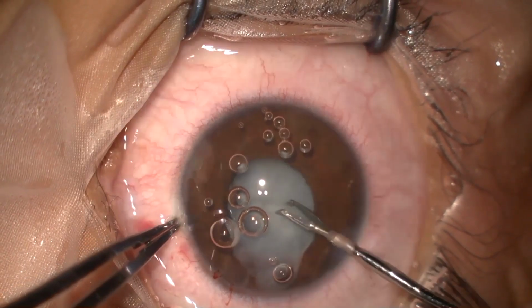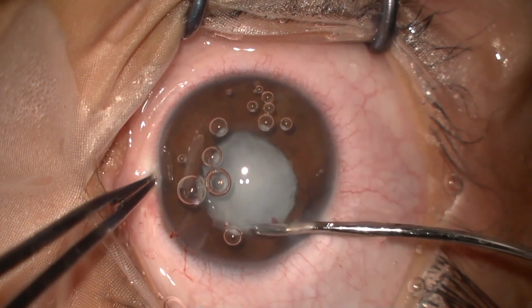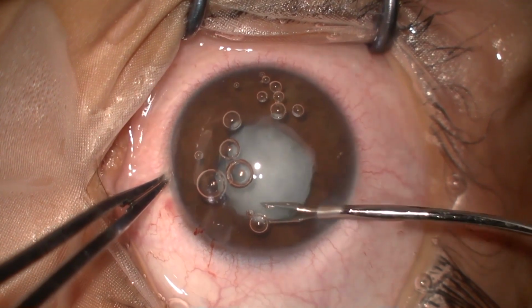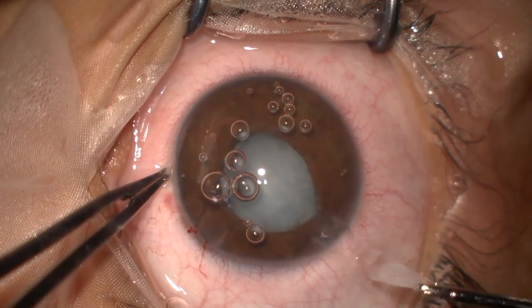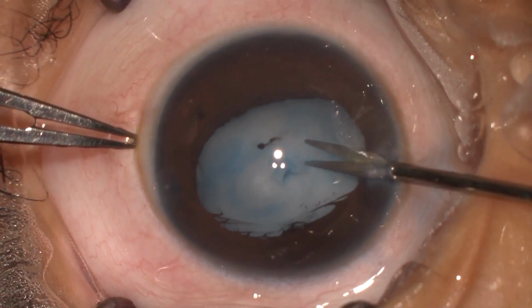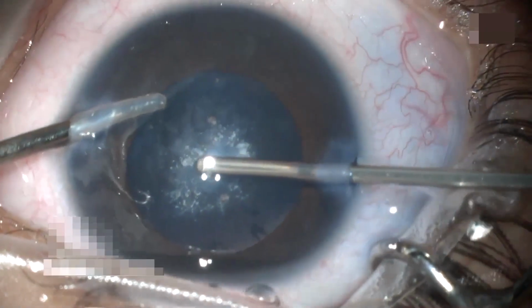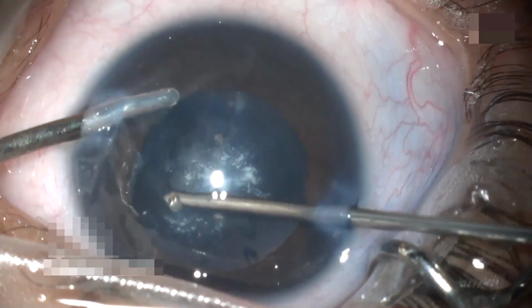In the presence of anterior capsular plaque, such as in uveitic or a complicated cataract, the plaque can either be removed using a rhexis forceps known as plaque rhexis or can also be excised using a vitrector or a pair of micro scissors. In a case of a runaway rhexis, a vitrector comes to the rescue to round out the capsulorhexis.